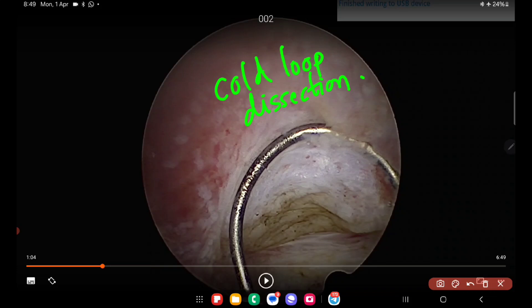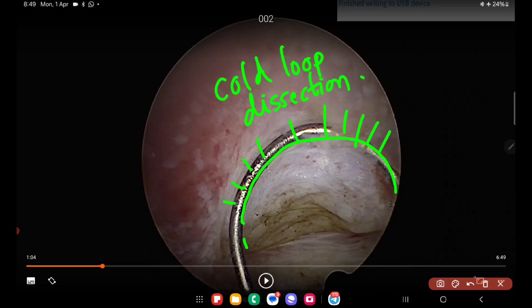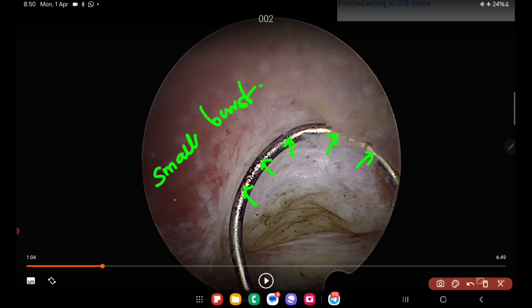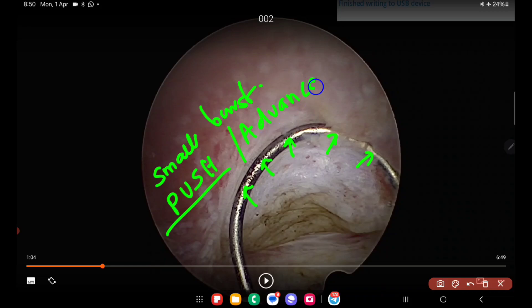Cold loop dissection uses the concept that there is a pseudo capsule at the outer limit of the myoma — just as in laparoscopic myomectomy — and that pseudo capsule holds the fibroid back. With movements of the resectoscope I push the fibroid away from the myometrium at the level of the pseudo capsule, and with the fibroid gently tented I give a very small burst of energy — pushing the fibroid away rather than pulling the resectoscope towards myself. Remember, this is only for surgeons who are quite confident with hysteroscopic surgery and represents an advanced level of technique.